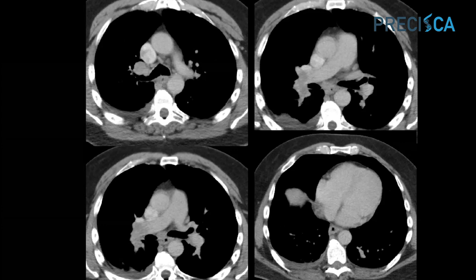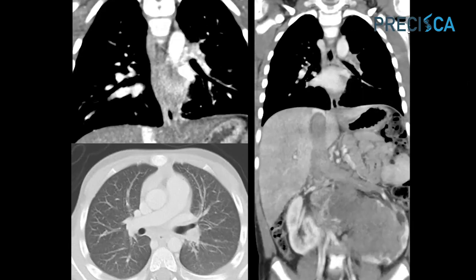I will tell you that with the tumor microemboli that we saw, it's unusual to see any macroscopic filling defect. The key there is to look on the lung windows. So in short, this case just illustrates that there is enhancement of filling defects within the pulmonary arteries.